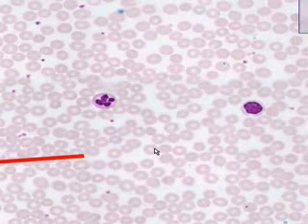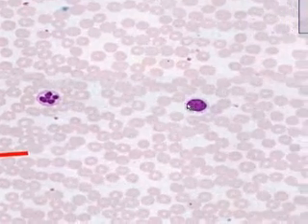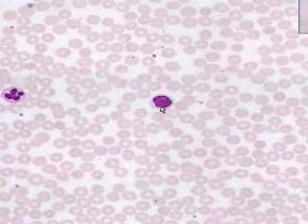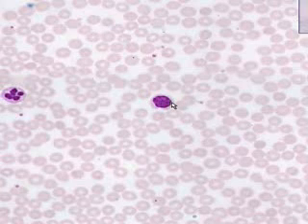The red cells average about 7 microns in diameter, but the more reliable measuring stick on a blood film is a small round lymphocyte containing a round nucleus and a minimal amount of cytoplasm. And the diameter of these is about 10 microns fairly reliably, which you can see is a little bit more than the 7 microns of the average red cell.